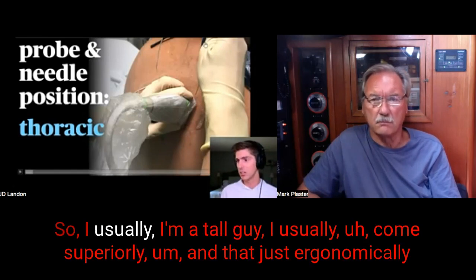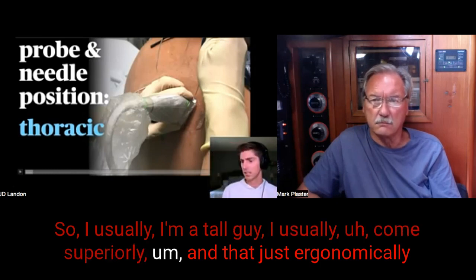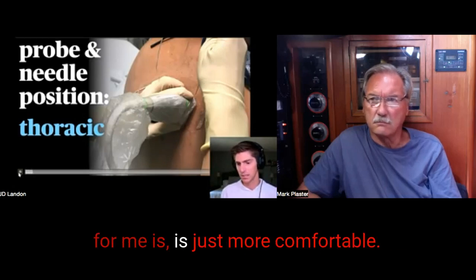Okay. So I'm a tall guy. I usually come superiorly, and that just ergonomically for me is more comfortable.